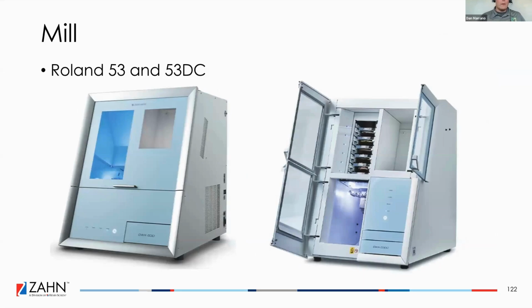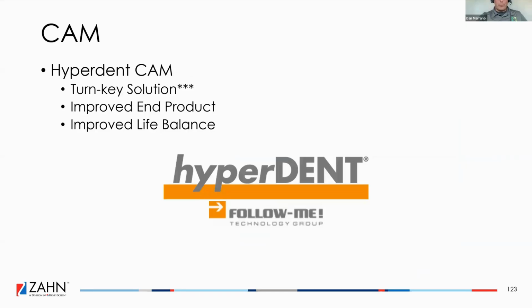The mills, we use the 53 DC here. I've shown in other webinars, we've run that thing for 24 hours straight, milling all-in-X restorations. There's a couple reasons for it. It is reliable, it's durable, and the tooling is available for it when it came out in the CAM. So hyperDENT CAM is something I've become really passionate about. And it wasn't always that way early on. I had to work myself into it because it was a transition point, just like anything. But this is, and I put an asterisk, turnkey solution.